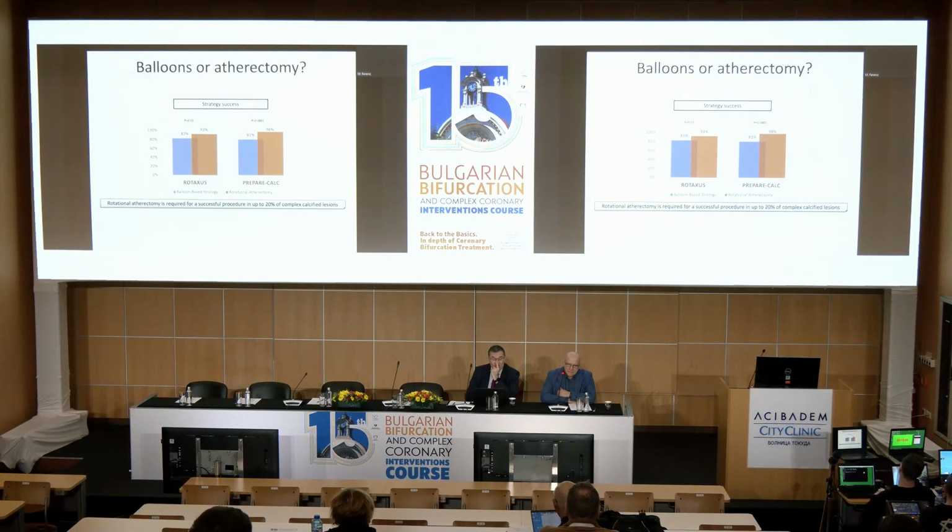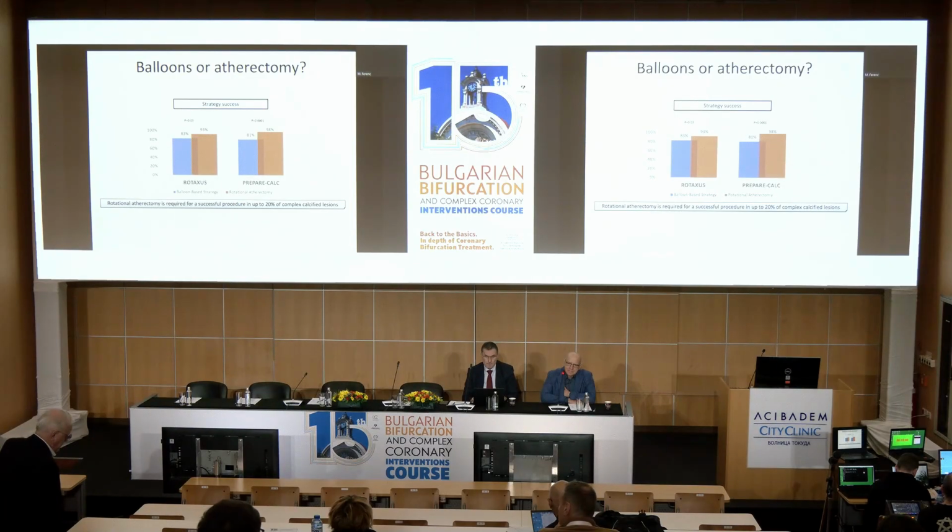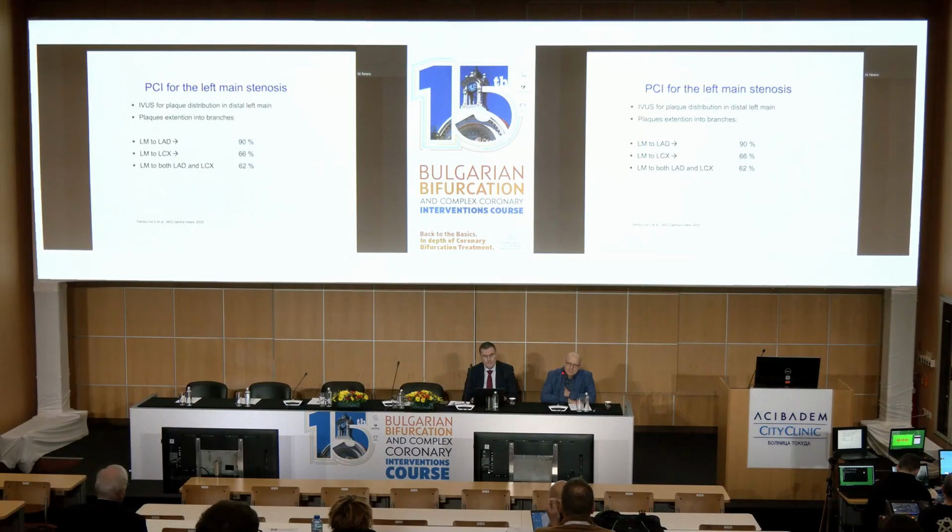And there are still some colleagues who believe all these devices are maybe not really needed. However, I can show you the data from two large German randomized studies, and whatever you do, you will find around 20% of calcified lesions which are definitely not suitable for balloons. So you have to go on top to ablative methods. So this is for sure. I think even in more complex lesions, maybe it will be 20-30% of cases.